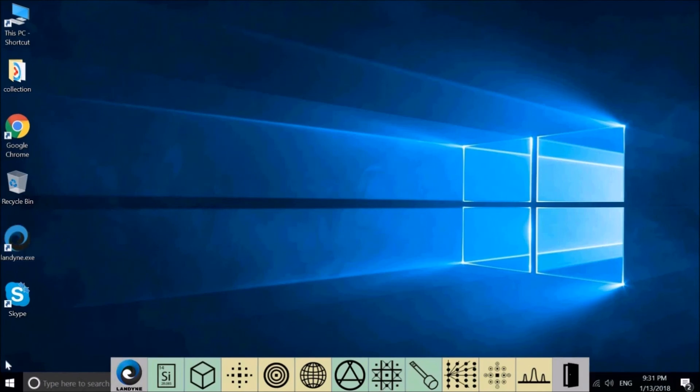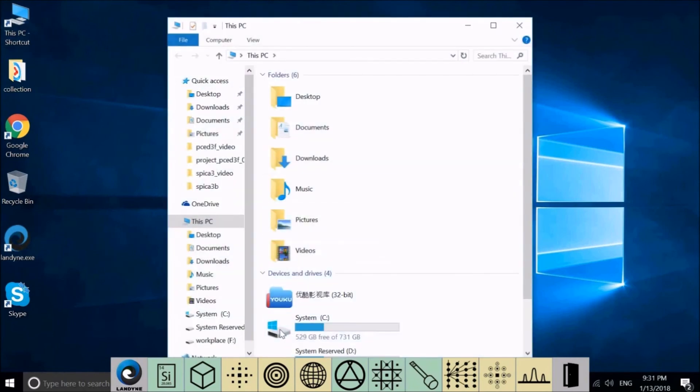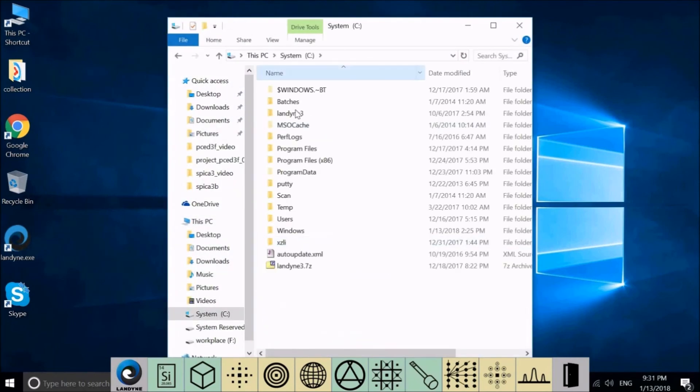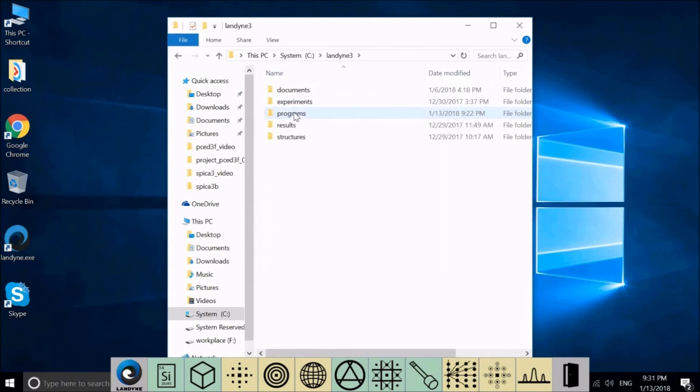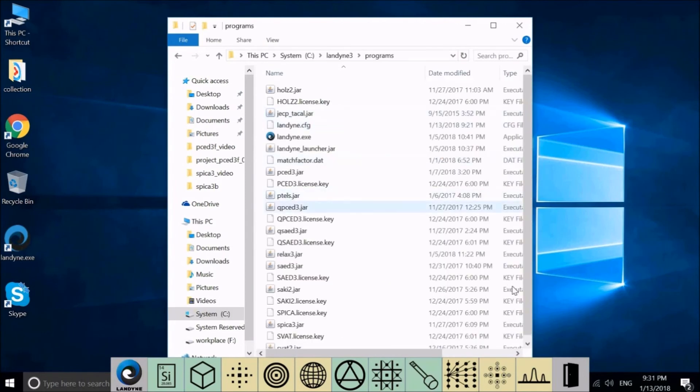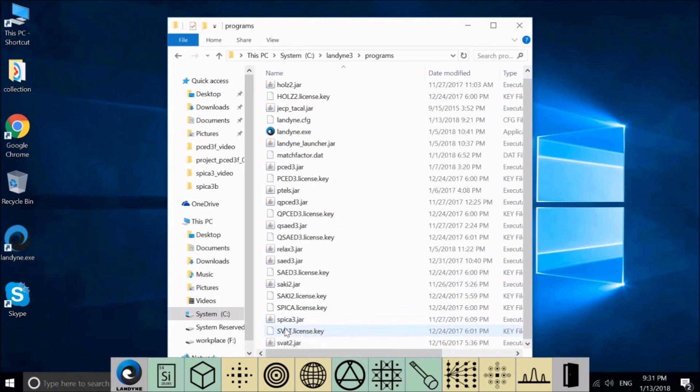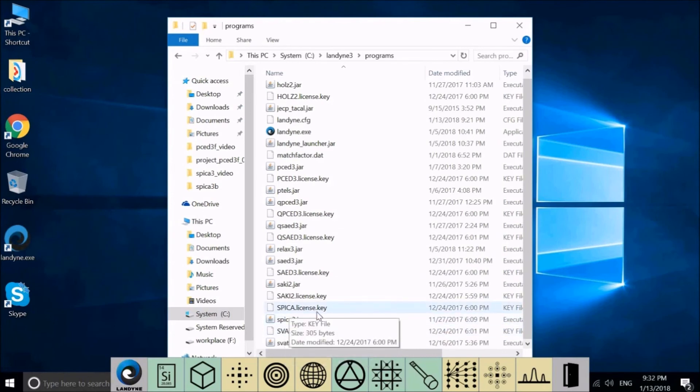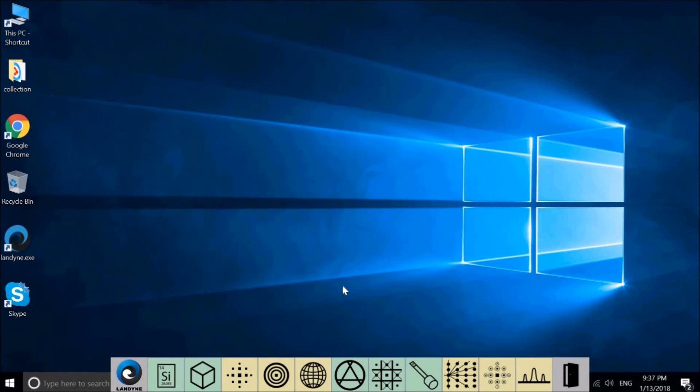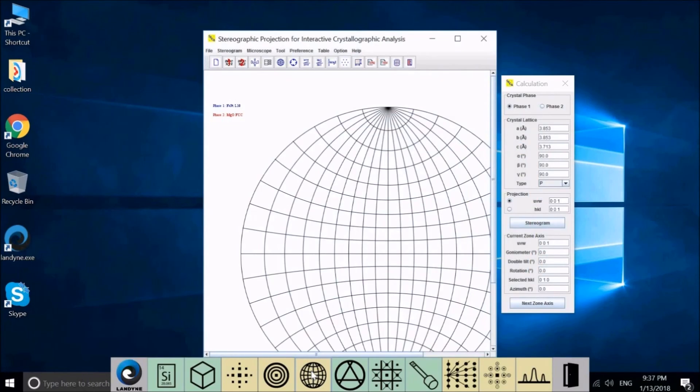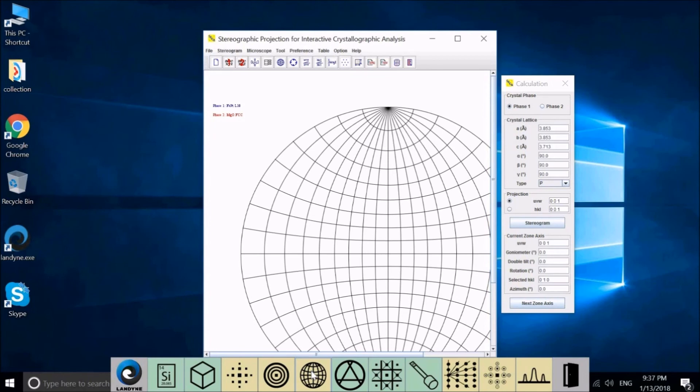If you have a license file, please copy the license file to C landyne3 programs, SPICA3. A license dialog may pop out in case you don't have the license file. Then you may select the demo mode to continue.